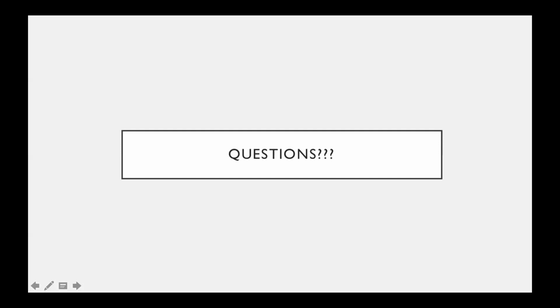Just one: do we use the number of B lines to guide diuretic therapy? What's your experience with that? What's considered abnormal when you're looking for B lines between two rib shadows? You need three or more to consider it pathologic. Greater than 3. If you're definitely seeing 7 between two ribs, that's significant. But greater than 3 means pulmonary edema is starting, an interstitial pattern between ribs.